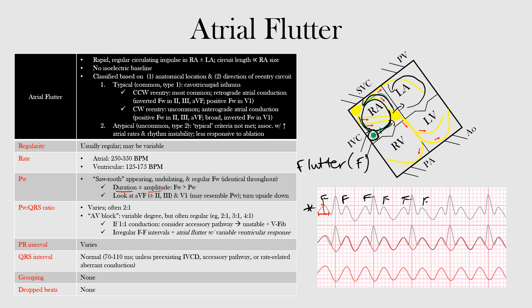Looking at a normal EKG or rhythm strip, the red portion highlights the flutter waves. Notice the undulating pattern — there are no flat baseline areas, just a continuous undulation. If you were to take all the flutter waves or atrial activity out, you would see a similar continuous pattern, confirming those are the flutter or F waves.